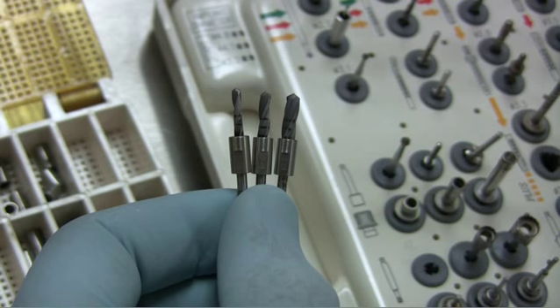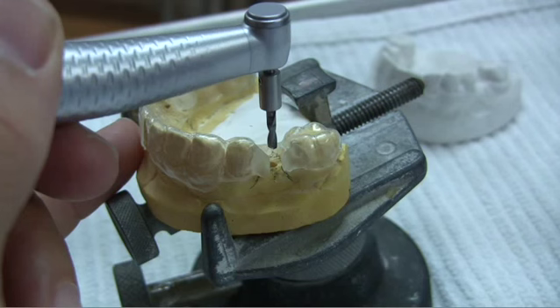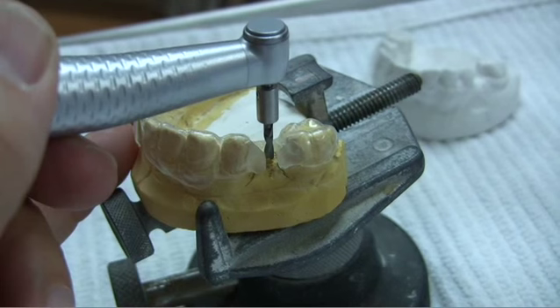The same drill stop, limiting your depth, will fit a 2.2, 2.8, and 3.5 Straumann or Blue Sky Bio drill. Now we can proceed with our normal drill sequence.